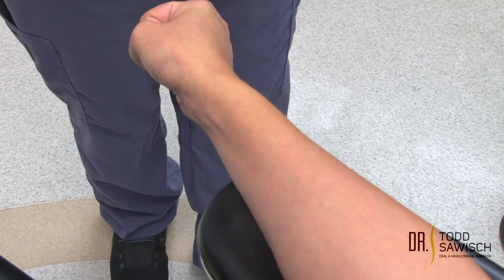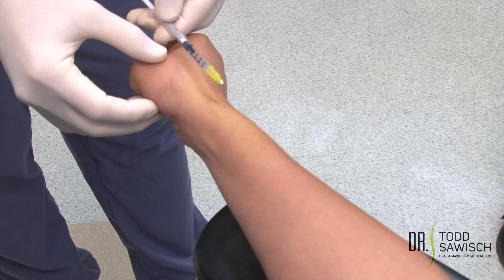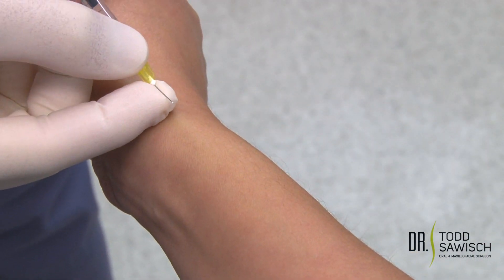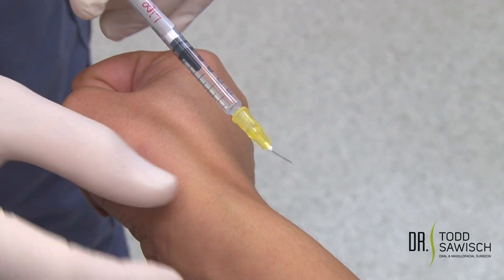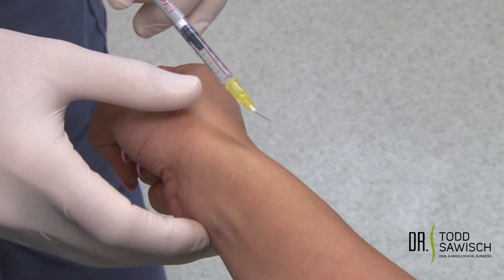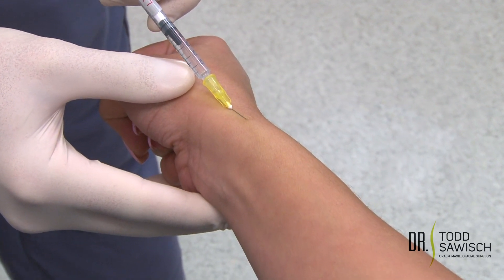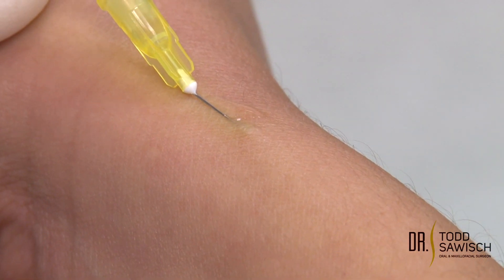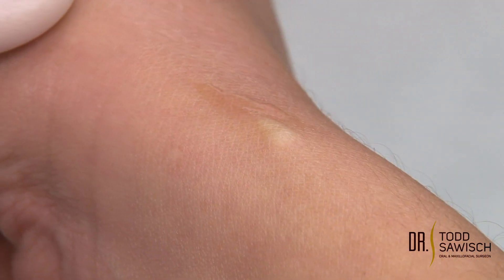The next thing we're going to do is administer local anesthetic. This is plain lidocaine with no epinephrine. You can see the bevel — we want the bevel facing superior, and we're going to bend this a little bit so it makes it easier to give a subdermal injection. The patient still has her fist closed and the tourniquet is still on. I'm going to palpate where the vein is. We're going to rotate the wrist slightly right over the vein. This is going to be superficial — we're going to go just underneath the skin, and you're going to see a little wheal pop up. We call it a subdermal wheal, and that's the local anesthetic, which is going to make it more comfortable for the patient.